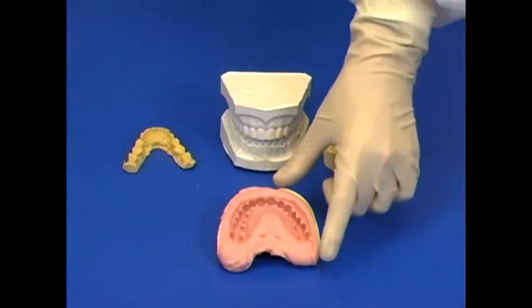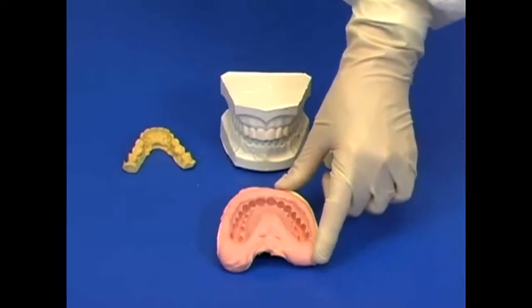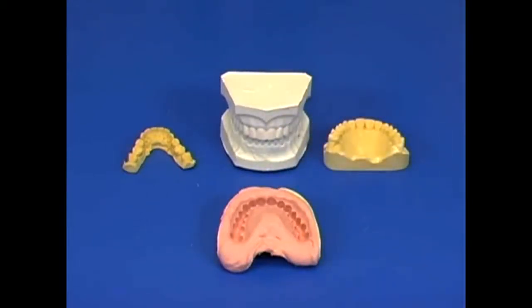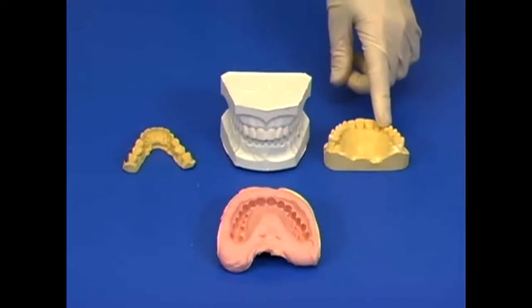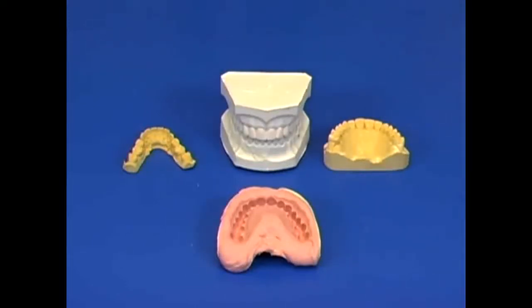The alginate impression is a negative replica of the patient's dentition. The impression must be poured up with a durable product to create a positive replica. We use dental stone or plaster to make a model that can be used for study models or lab work.